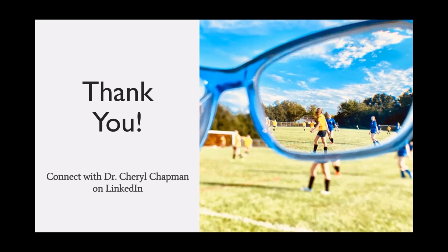So sometimes Ortho-K is a really fantastic option for those patients because dry eye is not a contraindication for orthokeratology. In fact, a lot of those patients do quite well because they get to have their eyes closed while the lens is on their eye. So those are all things to keep in mind. Oh yeah, those are really great points.